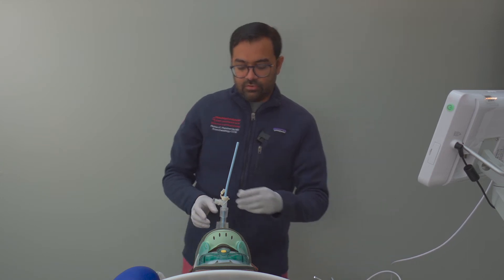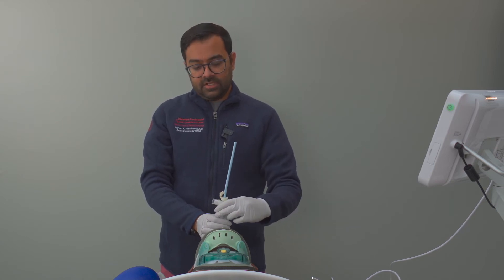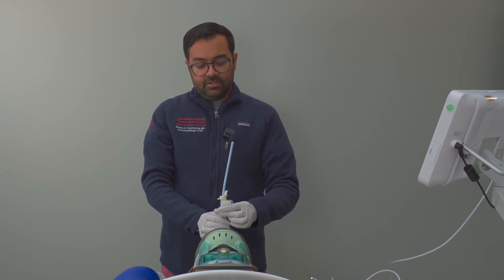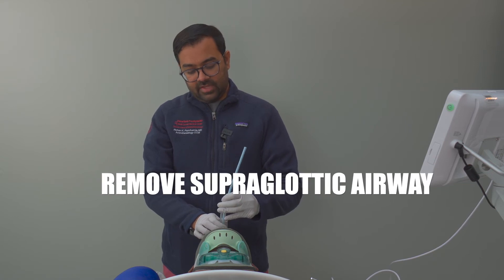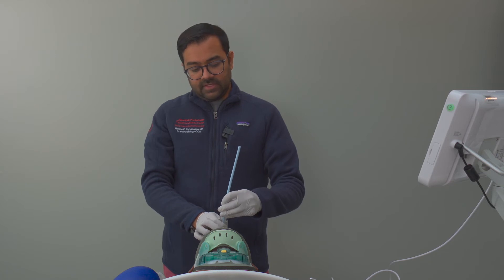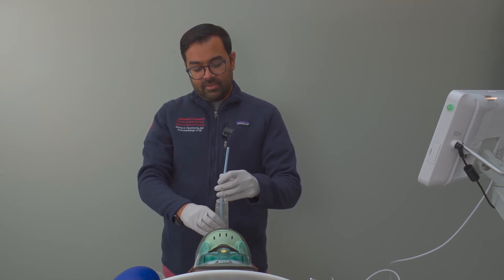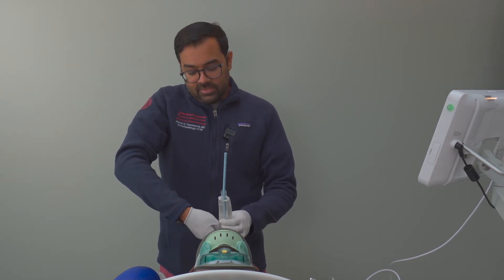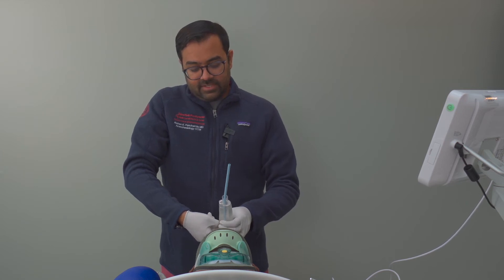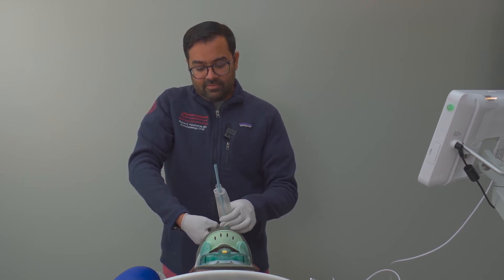The next step is to remove the supraglottic airway over the Aintree catheter. The Aintree catheter serves as a placeholder for us once the supraglottic airway is out of the airway. We'll remove the swivel adapter, then remove the supraglottic airway over the Aintree catheter. This can be done by counter-advancing the Aintree catheter just a few centimeters — no more than 26 centimeters at the lip — to ensure the Aintree catheter doesn't migrate out of the airway while the supraglottic airway is being removed. I'm going to use my right index finger to tack the Aintree catheter, as another step to make sure it doesn't move while the supraglottic airway is coming out.